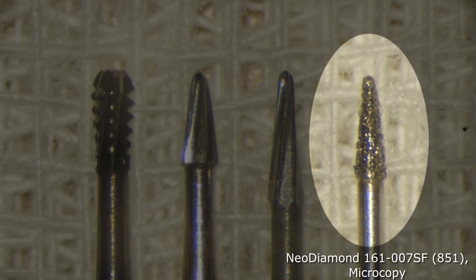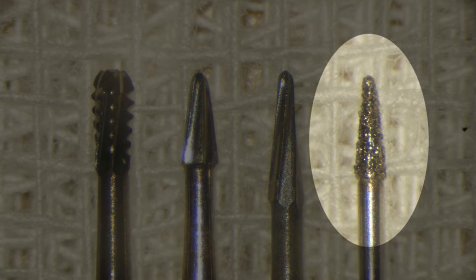The neo-diamond burr from Microcopy is intended to be single-use per patient. This means that the burr is sharp and I don't have to worry about the cutting efficiency, and the price of the burr is affordable.